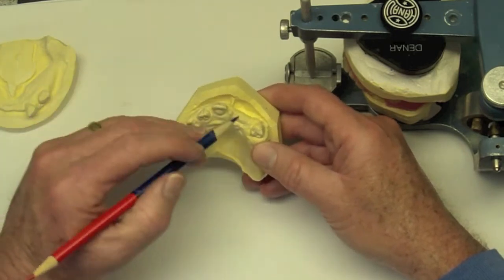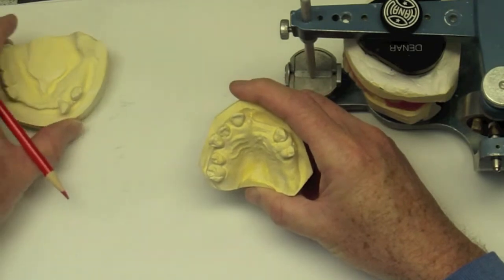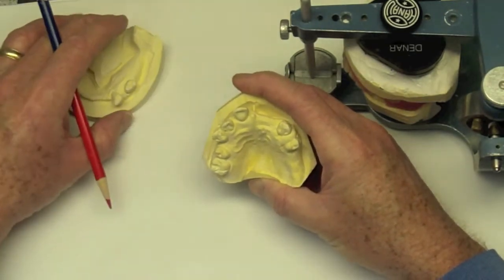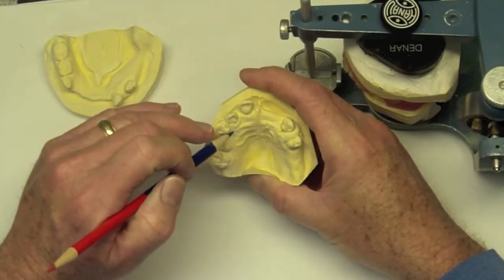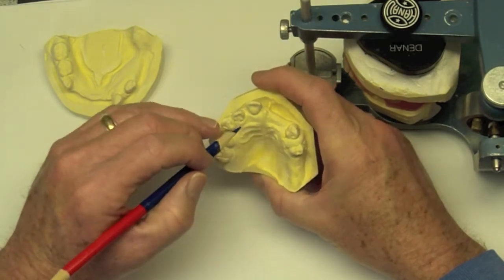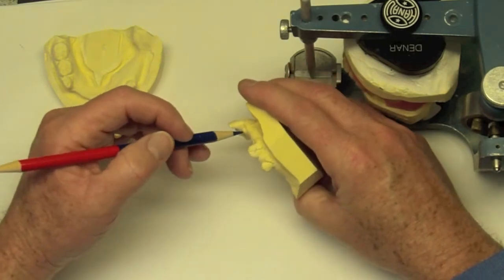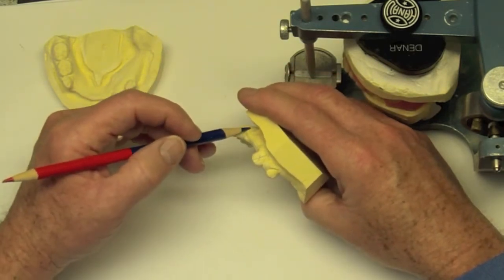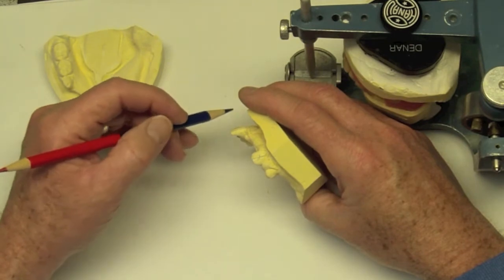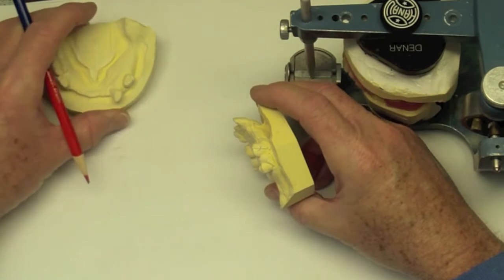And then, ultimately, we're going to go ahead and fabricate the maxillary and mandibular complete denture once we have adequate healing of this ridge. And most likely, we'll have to probably do some additional alveoplasty. We'll get some shrinkage with healing, but as you can probably see, we still have quite a bit of an undercut here. So we'll probably do alveoplasty at the time that the immediate denture is made.